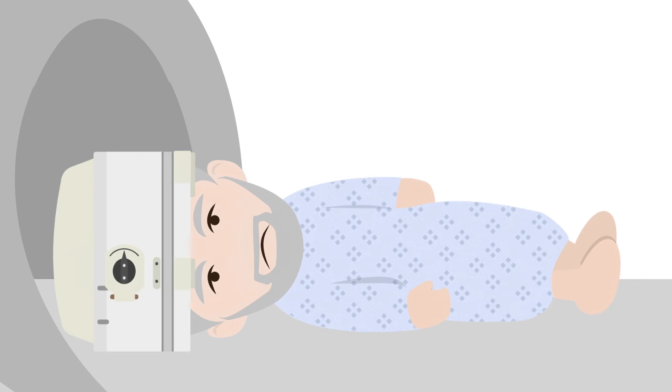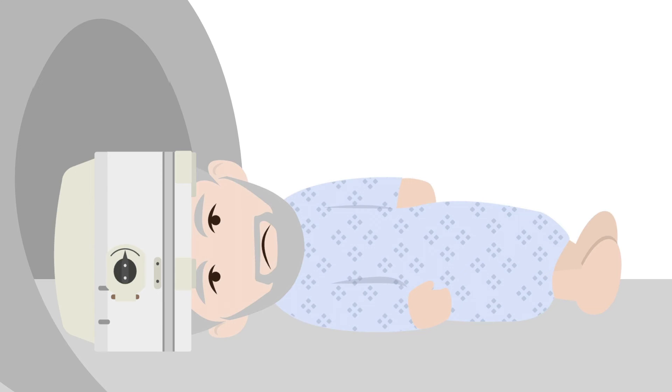After each short burst of energy, patients are pulled out of the MRI machine to test their tremor. Multiple repeated bursts of energy may be necessary to treat the tremor. Unilateral thalamotomy with MRI-guided focused ultrasound has received regulatory approval in multiple countries to treat medication-resistant tremors in Parkinson's disease. In the U.S., unilateral pallidotomy with MRI-guided focused ultrasound has also been approved to treat dyskinesia and motor symptoms. Because no surgical incisions are required, MRI-guided focused ultrasound has emerged as the main method to perform a lesioning procedure.